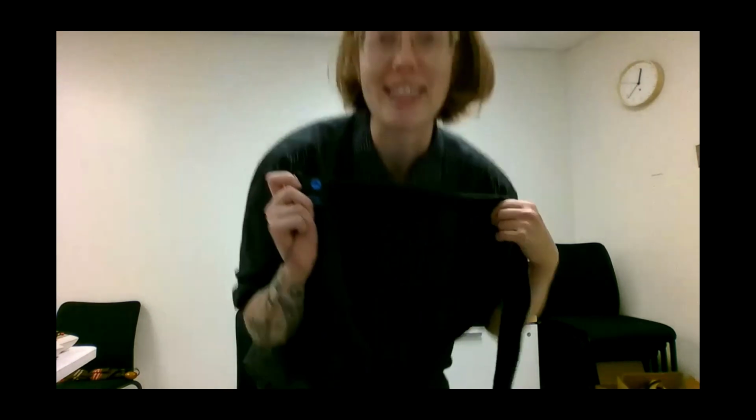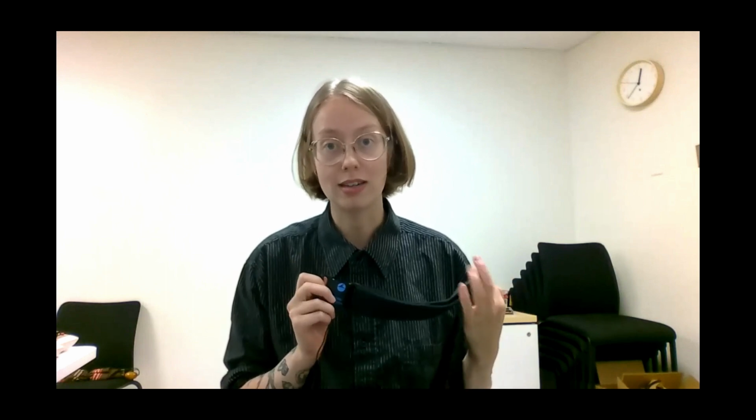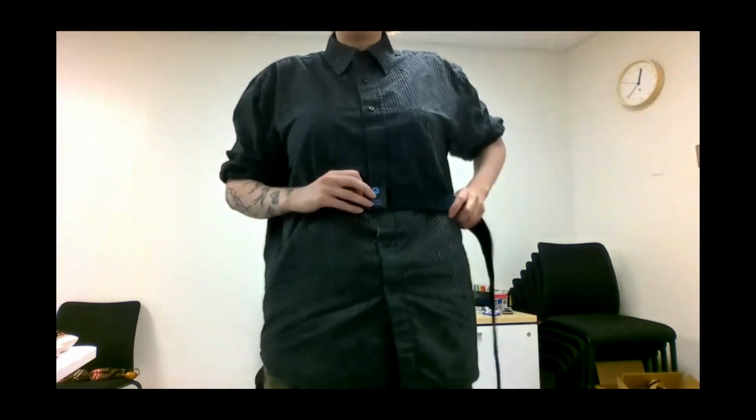That said, how someone is breathing can shift a lot depending on what you're asking them to do, and changes from going between sitting and standing, or how nervous they are during a scan. But it's important to pay attention to and consider repositioning if you're not getting the signals that you want to see. Okay, I'm going to go ahead and put the belt on myself.